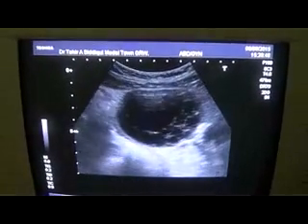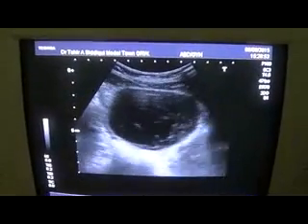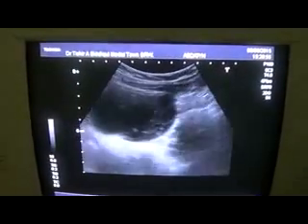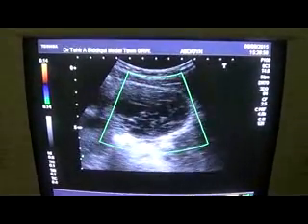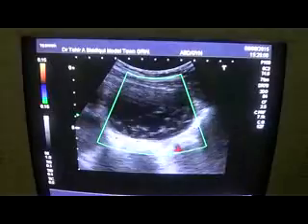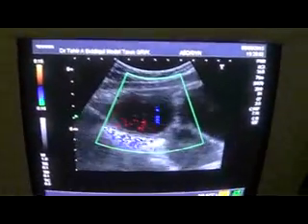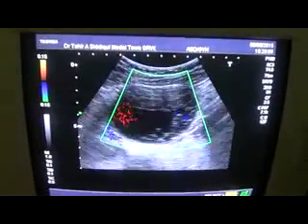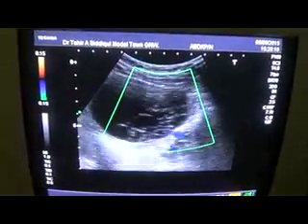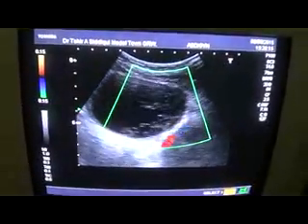So this is a very typical hemorrhagic cyst or endometrioma, though there are two differentials for this, either endometrioma or a hemorrhagic cyst, whereas the right ovary is normal, and she is suffering from primary infertility because of this. So far, no one has advised any workup in 3 years.